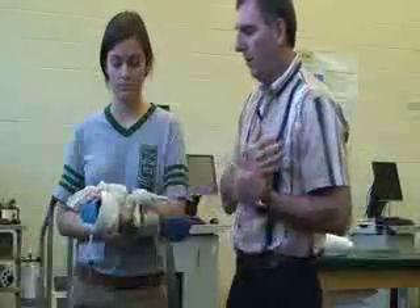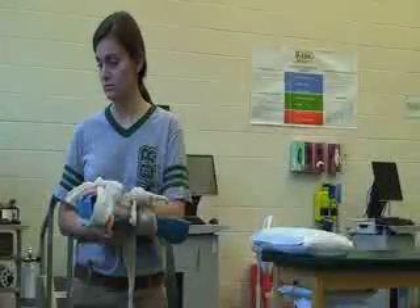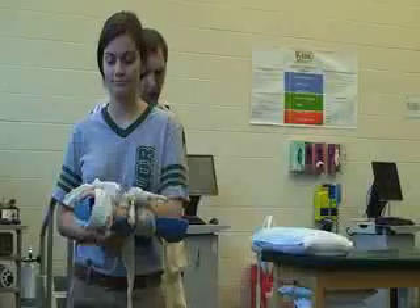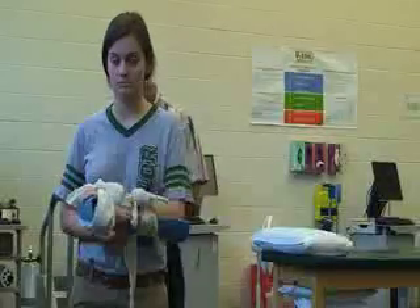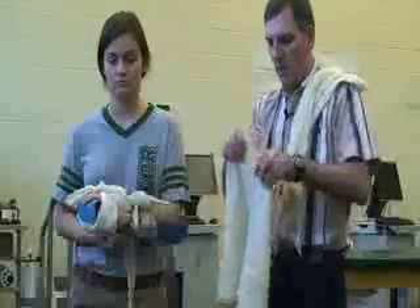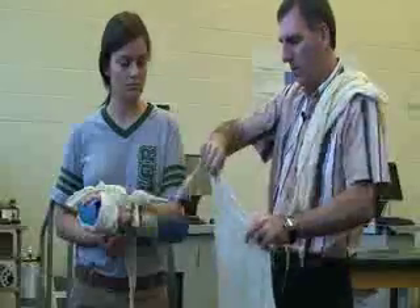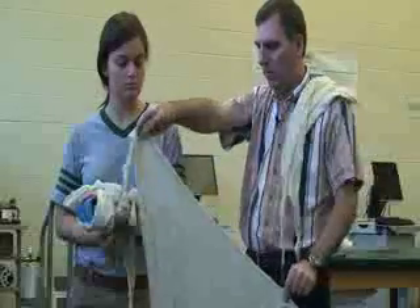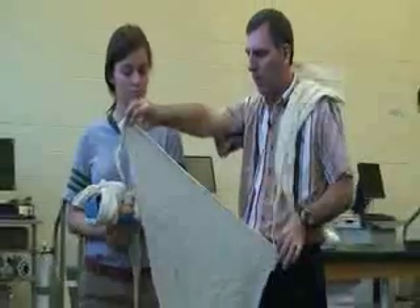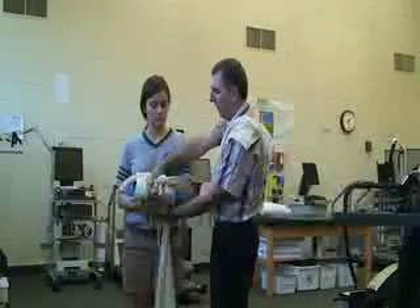Once she's in this position, you still want to help give her some more support. So now I'm going to use a sling and swathe method with triangular bandages. While she's holding her arm there, I'm going to make my triangle so that the middle edge of the triangle is facing the elbow, the top is facing towards her head, and that's going to go up on the inside.